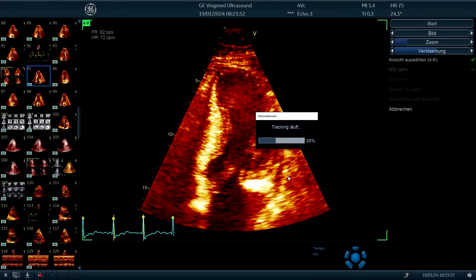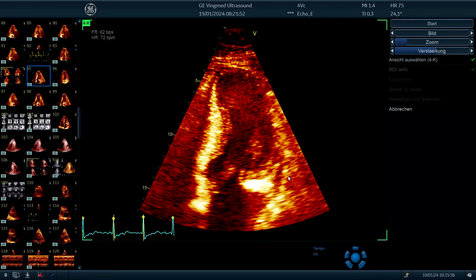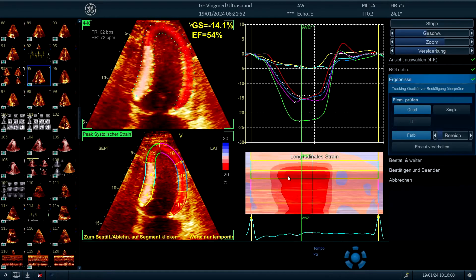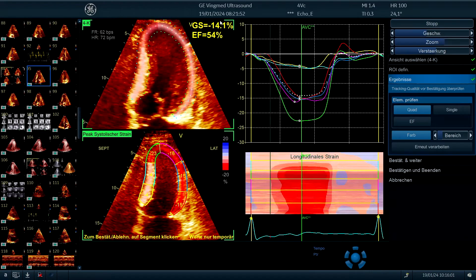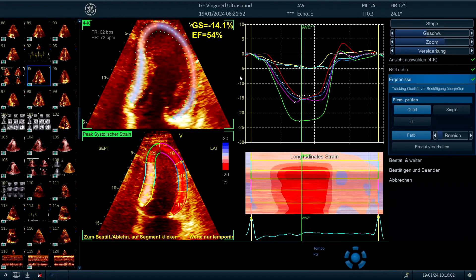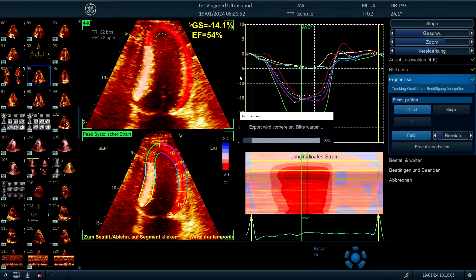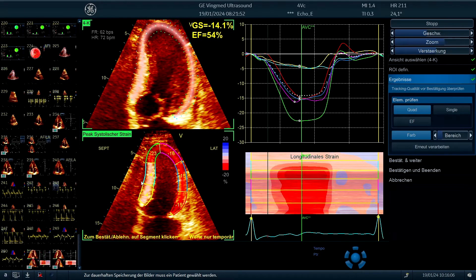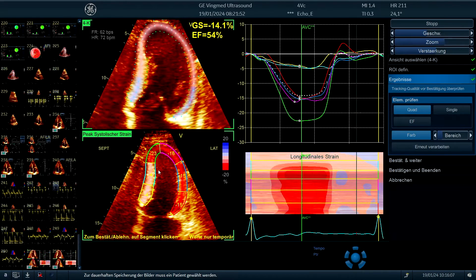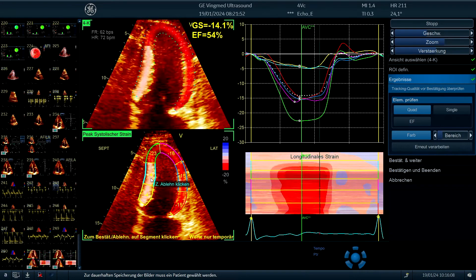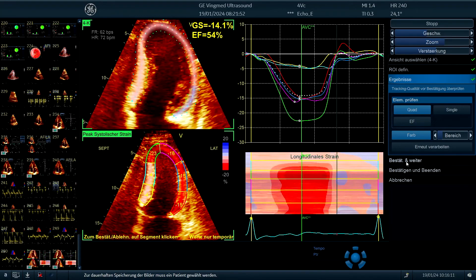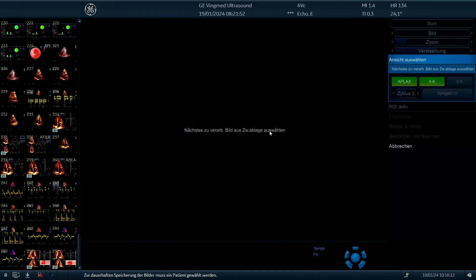Now we process and we see also here the strain is reduced, the ejection fraction probably a little bit underestimated, but we do see curves and in the region where the heart muscle is the thickest, it's definitely reduced.